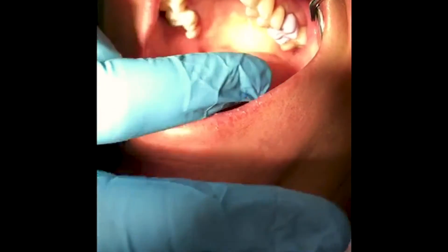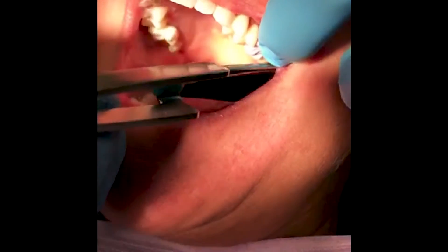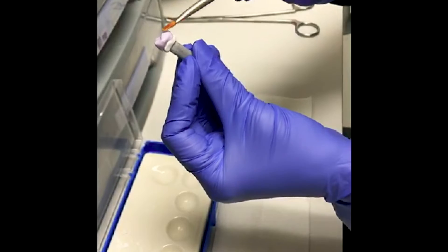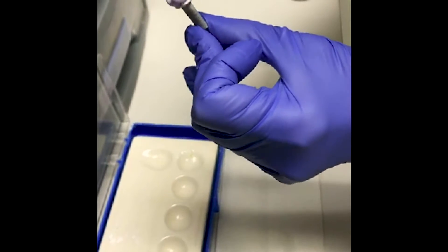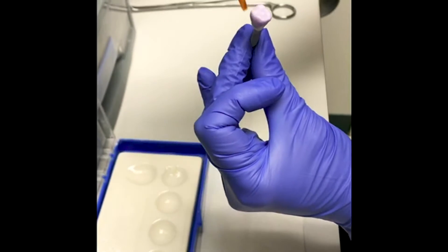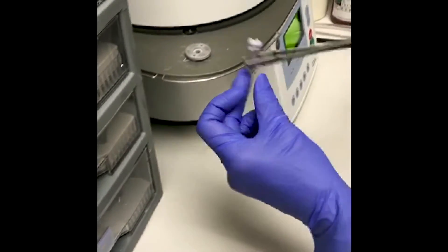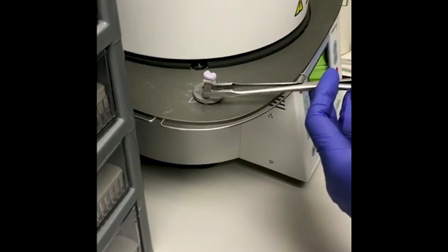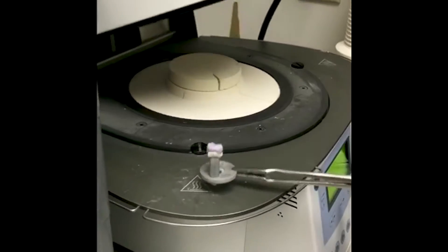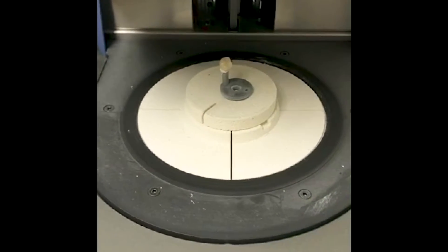We'll make sure that it fits your tooth exactly — the fit is usually amazing, it's very precise. We'll make sure everything fits the opposing teeth as well, check the bite, and then we'll take it to the back, glaze the tooth, and get it ready for baking in the oven. This porcelain will bake at about 1200 degrees for about 15 minutes, and that will harden it.